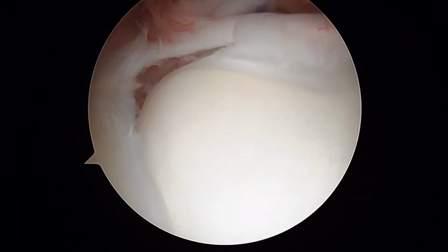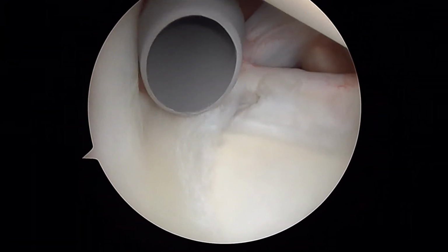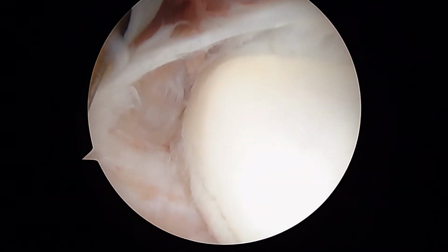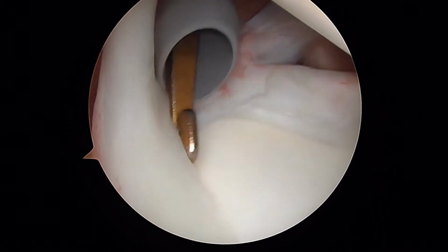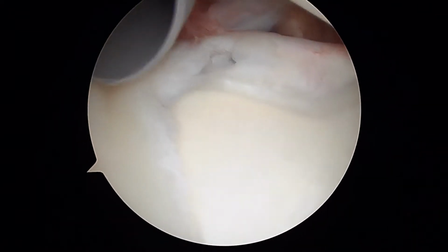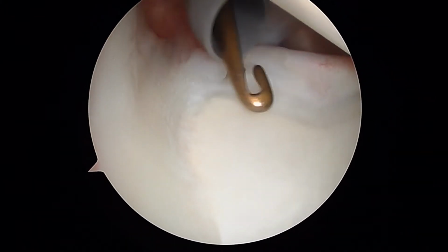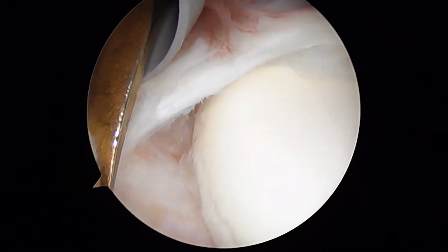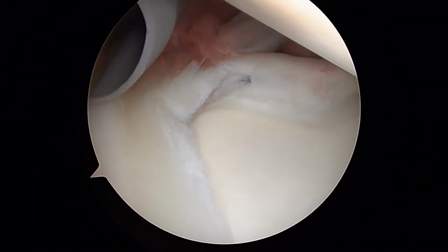See how that reaches or lifts off. Can I get a crochet hook? Thanks. I'll just demonstrate the laxity or the instability. See how that lifts off like that? That's a problem, and we're going to take care of that problem by doing a biceps tenodesis. There are other options, but in my experience, with what you like to do for a living, your activities and your age, the biceps tenodesis has the best long-term result. But that is what a type 2 SLAP lesion looks like here.